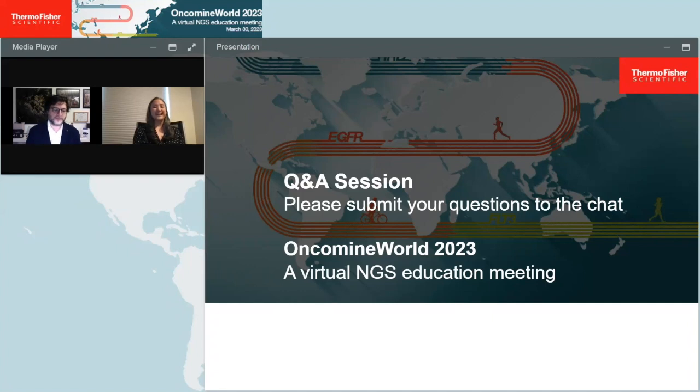Thank you. Great. So the question is, if you see something with a GIM score above a particular threshold, how do you know if it's real? Do you retest it? Do you look for BRCA mutations? I think being able to see a BRCA mutation within a sample that is genomically unstable high does make sense and gives a little bit more confidence.